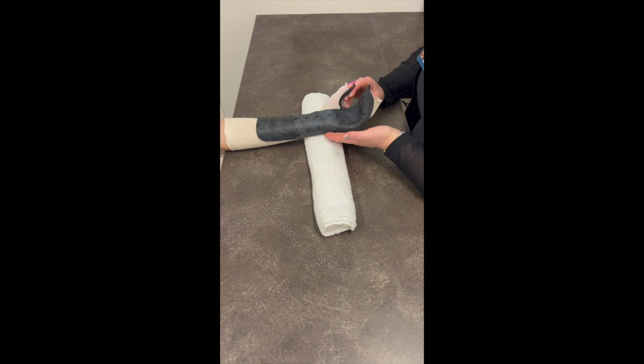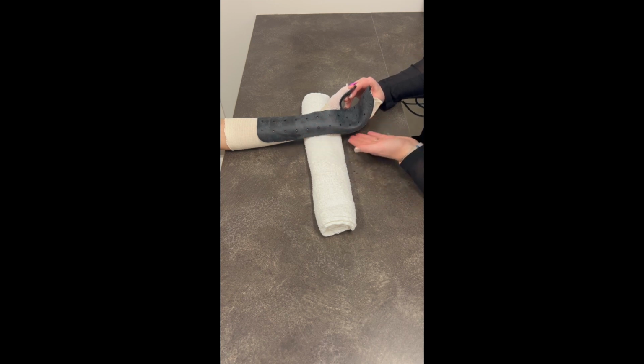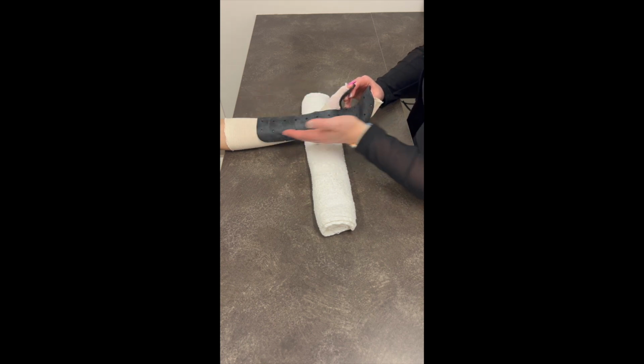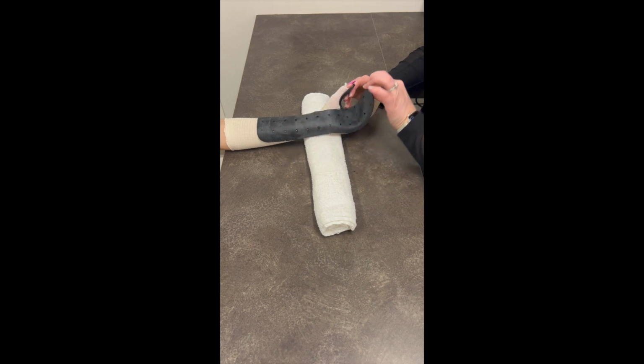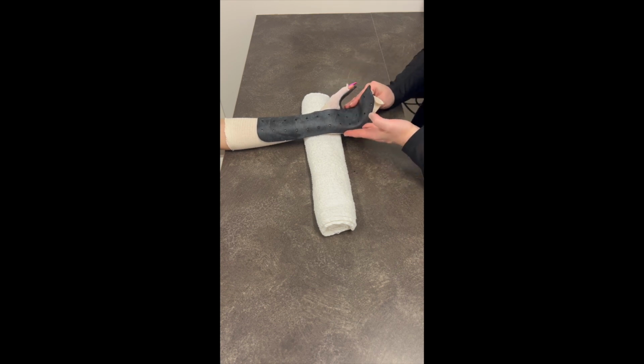And once the material is hard, then you can mark for any trimming that you need to do. On this orthosis today, we do not need to trim anything, but a couple places to watch for. Just make sure it's 2/3 of the way down on the forearm, halfway up on the forearm, the hand, and the digits. Make sure the finger portion is not too long, as well as the portion for the thumb.